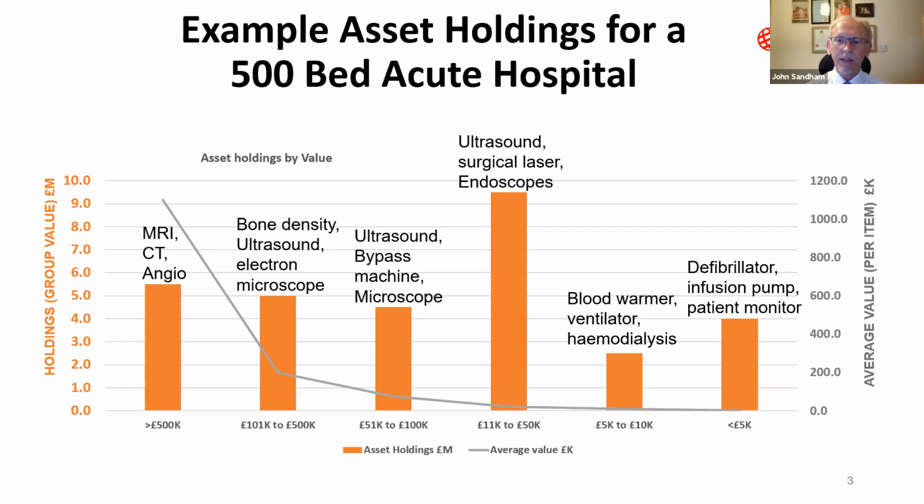value. The choice of what items to buy is often based on age rather than having a replacement plan that is linked to long-term operational business strategy. In my experience, organisational cost pressures can be offset by investing to save. Investing in the right technology at the right time should be linked to your long-term transformational plan, which will then deliver planned operational improvements.